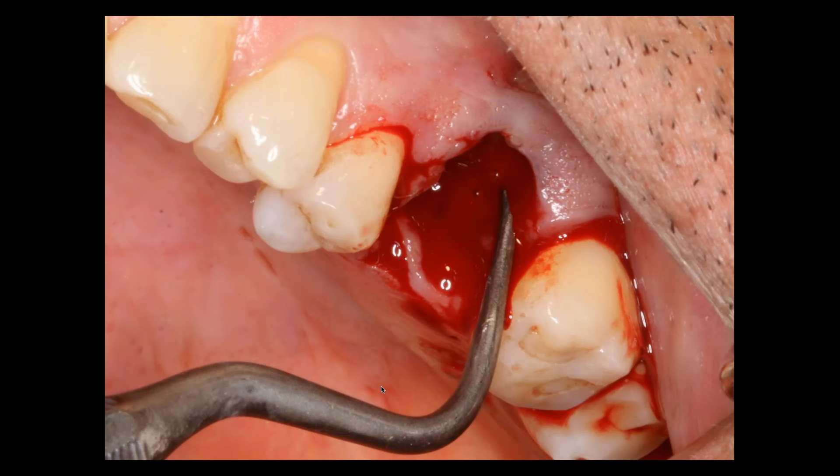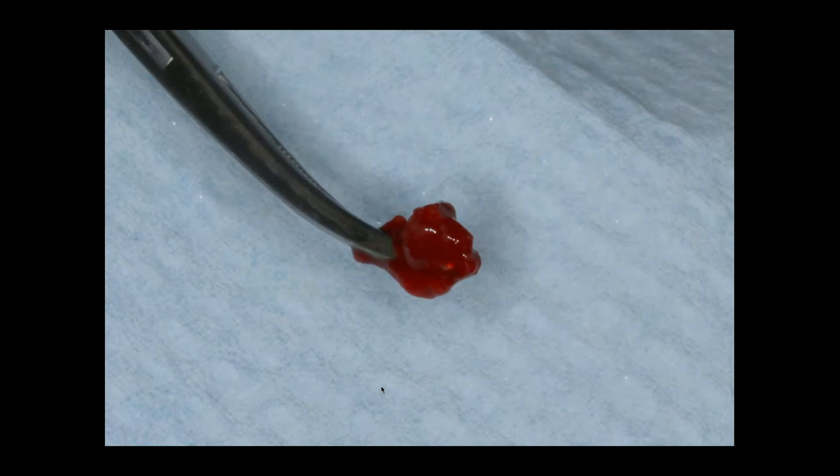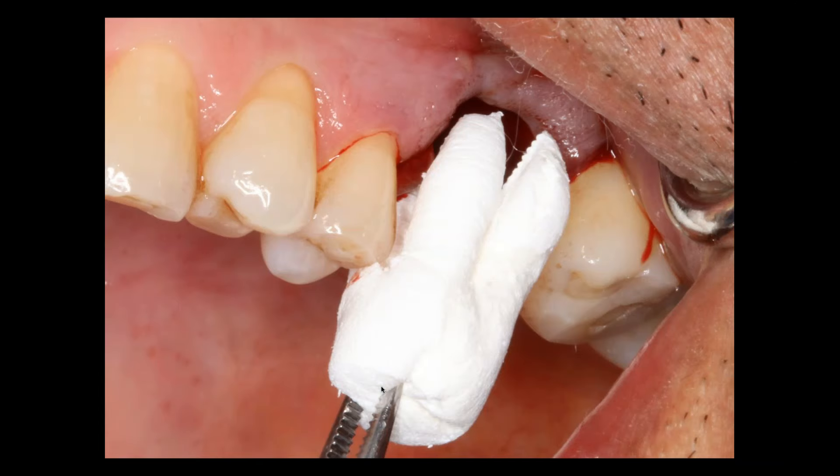It's very important, though, when we remove the tooth in preparation for socket preservation that we curette, curette, curette. We want to remove any granulation tissue from the socket. We want to remove any purple blood. We want to remove the lamina dura from the palatal aspect of that socket. So you're going to want to have sharp curettes and be aggressive in that site. You can see the large granulation tissue cysts that we removed from that site — it was a real mess.